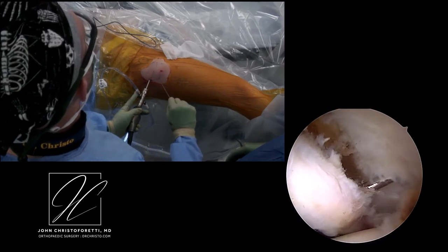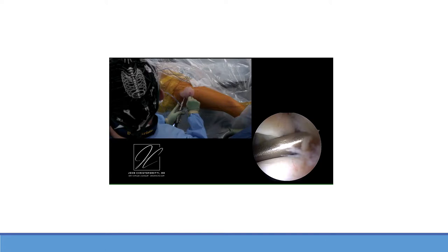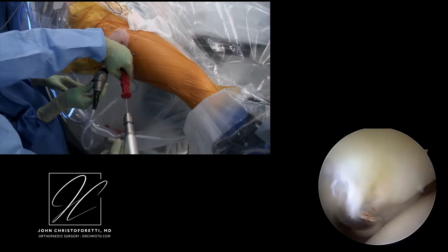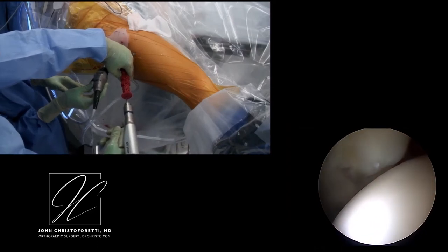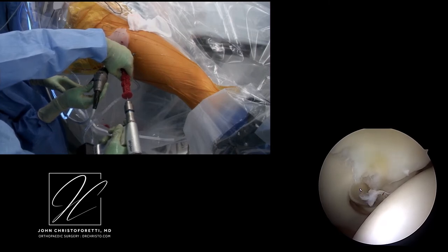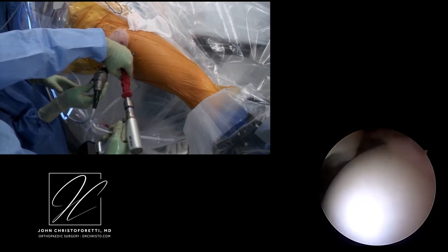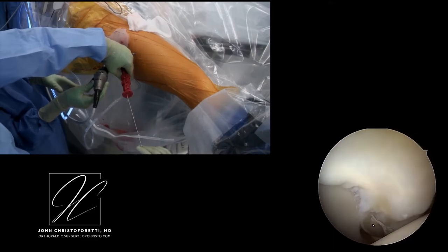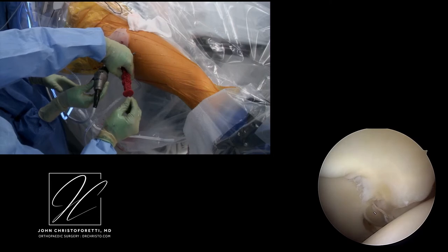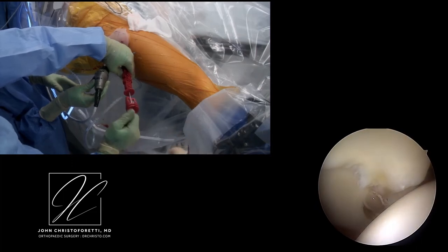Next we assess the angle and demonstrate the distal anterolateral accessory portal access. Once the distal anterolateral accessory portal is established, we move to this anchor — one that is capable of being placed through the drill guide immediately following the drilling socket. The outside view demonstrates the assistant holding the camera steady while the operative surgeon drills the pilot drill guide. We view the articular surface intra-articularly at all times to avoid penetration. We use a nitinol wire to tap and sound the bottom of the hole to be certain we have not penetrated the deep table of the pelvis, and then the all-suture knotless anchor construct is placed inside the socket.